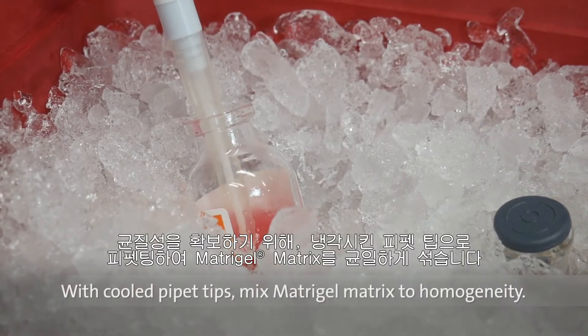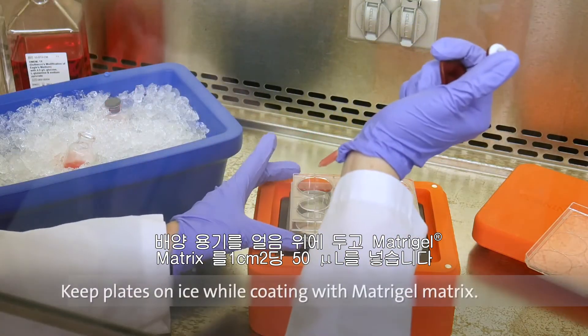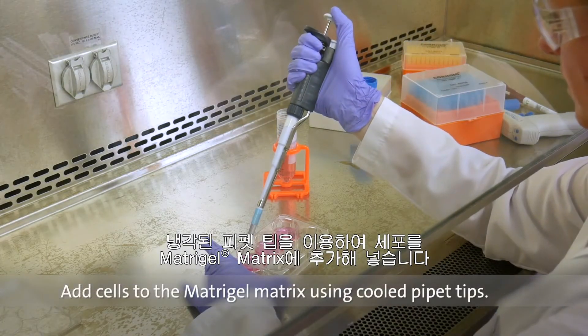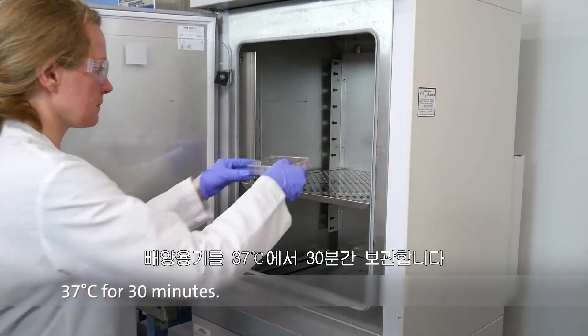Using cooled pipette tips, mix the Matrigel Matrix to homogeneity. Keep culture plates on ice and add 50 microliters per square centimeter. Add cells to Matrigel Matrix and suspend using cold pipette tips. Place plates at 37 degrees Celsius for 30 minutes.